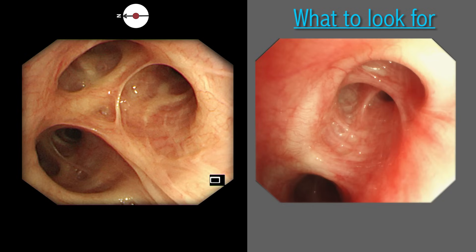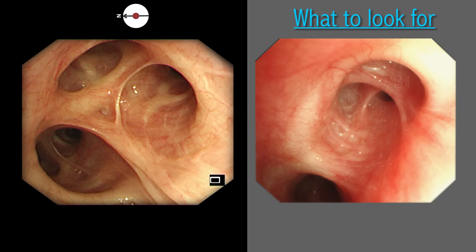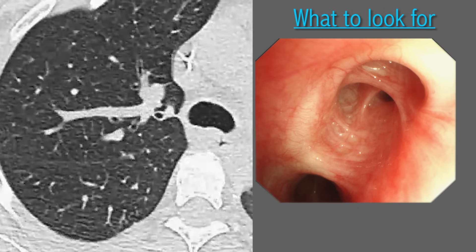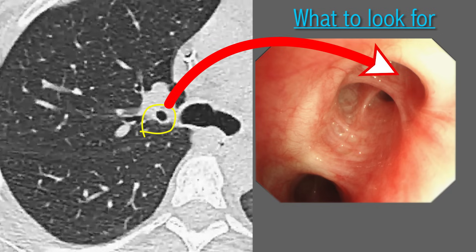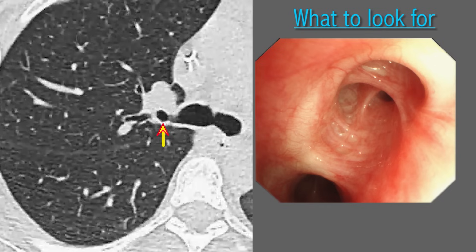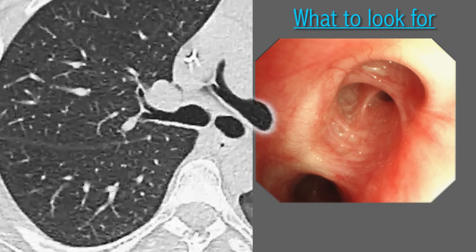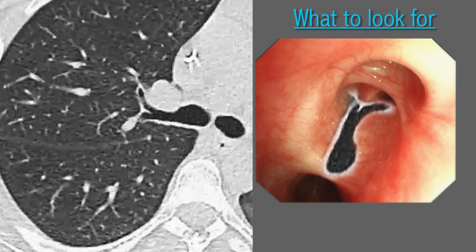Another common variant is two divisions that soon branch into three bronchi. In the example shown, the anterior and posterior segments share a common orifice. Identification of these abnormal orifices can be confusing, and I usually go back to scrutinize the CT scan to tally with the bronchoscopic findings. On the CT scan in this case, the upper lobe bronchus is seen foreshortened all the way down to its origin from the right main bronchus, and then the anterior and posterior bronchi are seen branching from a common stem.